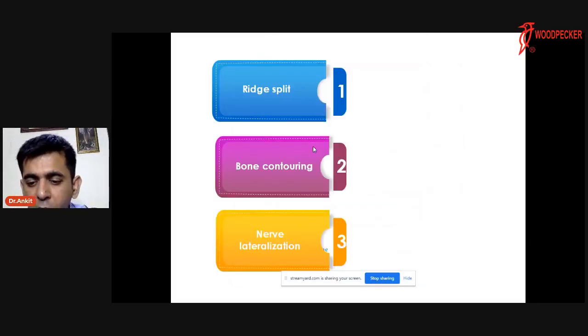Okay, now considering today's agenda, that is implantology, we'll be dividing it as per the uses of piezotome into three halves. Though there are many applications, I have considered these to be included in a 1 hour lecture, so that we can focus on them, study them, and detail them out, so that we'll be able to do the procedure if at all required in our clinical practice, right?